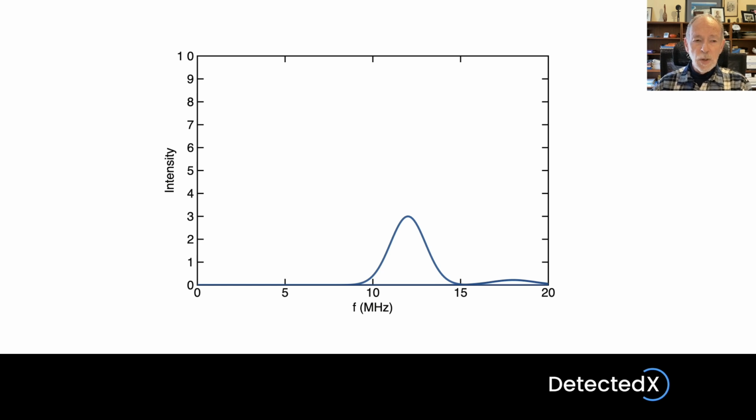Now the third and higher harmonics are going to become insignificant because those very high frequencies will attenuate extremely quickly in the tissues. The machine is capable of removing the fundamental frequency component from the echoes and retaining this harmonic component.